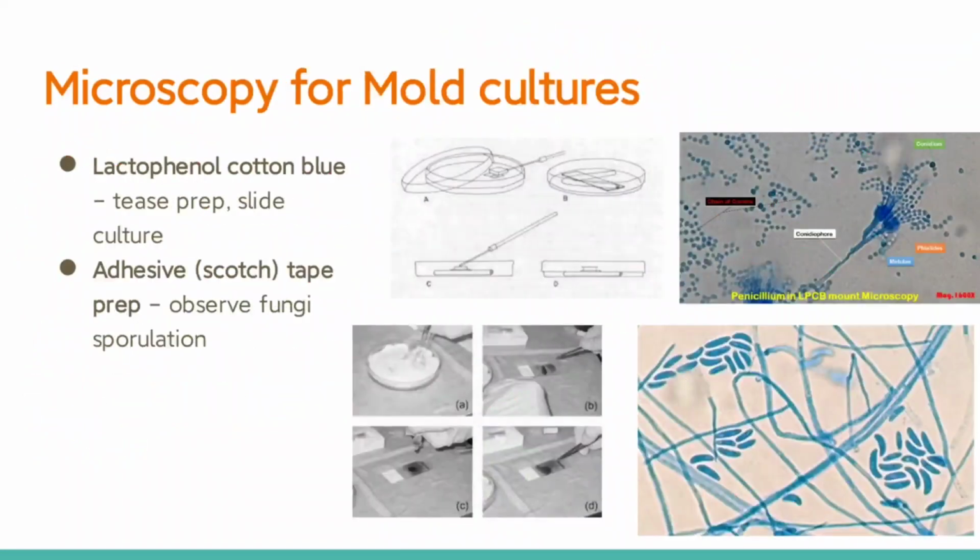Okay? Next, we have the microscopy naman for mold cultures. So, yung kanina, direct staining yung mga yon, in general na yon for all fungal elements. Mapa yeast yan, mapa molds yan. So, dito, specific only for mold cultures. So, pag may tumubo na mold dun sa inyong culture media, okay, you can perform these two microscopic techniques. The first one is you use the lactophenol cotton blue, or tinatawag nating LPCB, no? Lactophenol cotton blue.